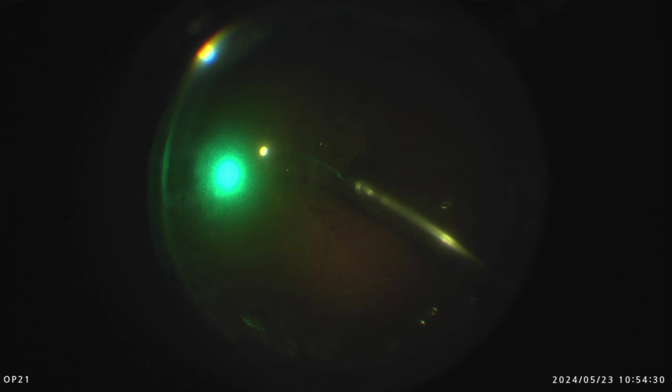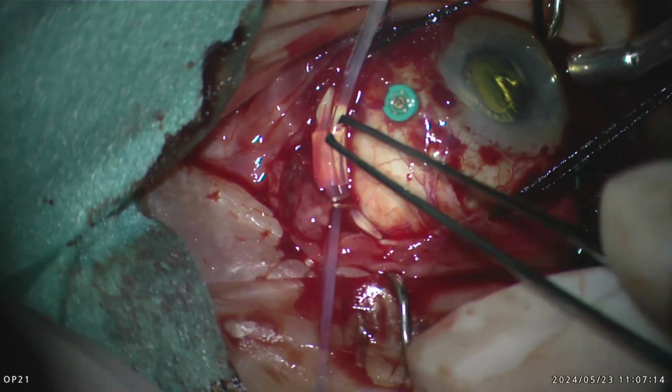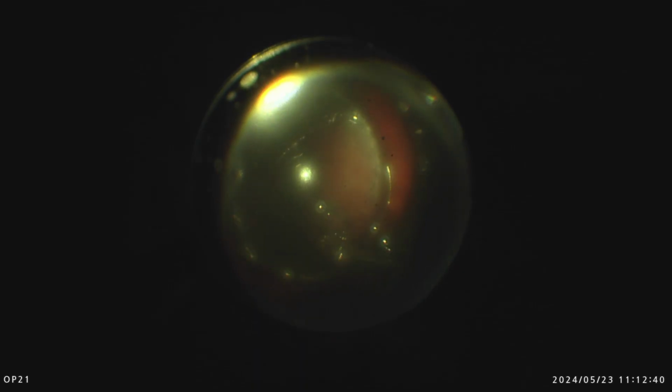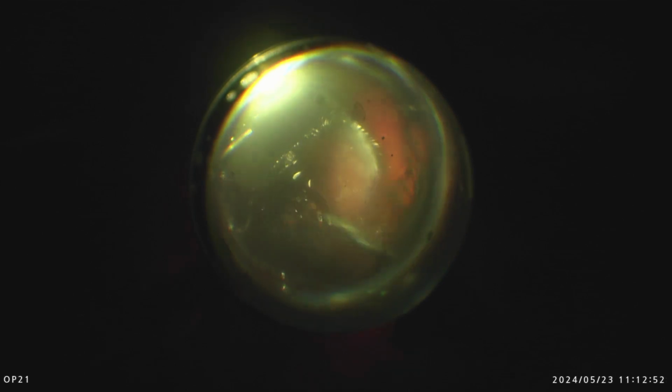So, thorough laser around the retinectomy edges, tighten up that encircling band under air, and fill the eye with 5,000 centistoke silicone oil for permanent use.